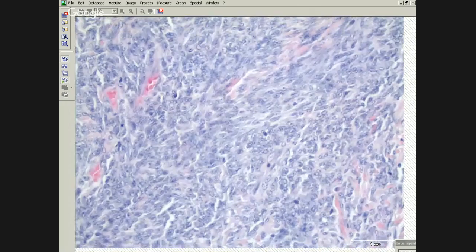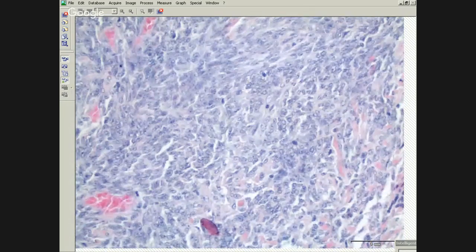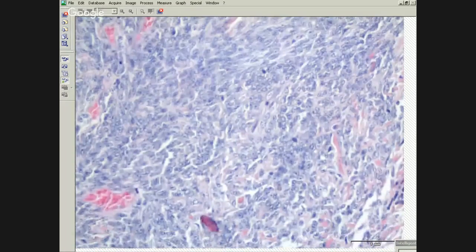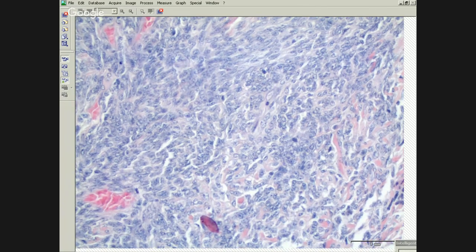In the pleura, any of the synovial sarcoma subtypes can occur, but the majority of them are monophasic. In my experience, they all look pretty similar to this one. They tend to occur in a little younger population than your typical mesothelioma patient, so that should be a clue as well, although they can occur at any age.